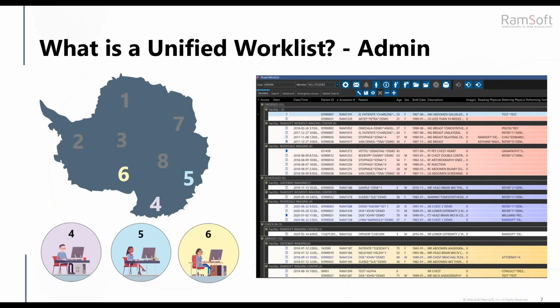So there's no need to dial an extension or yell across the room, that's really not the ideal way to do it, right? Or dial an extension and nobody's going to answer because they're busy scanning patients and so forth. But they will more than likely have that phone in their pocket like all of us do, right? So they're going to get that message. They're going to feel the vibration or hear a ding or something, and they'll look at that notification.